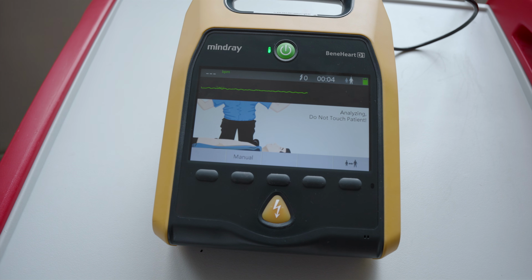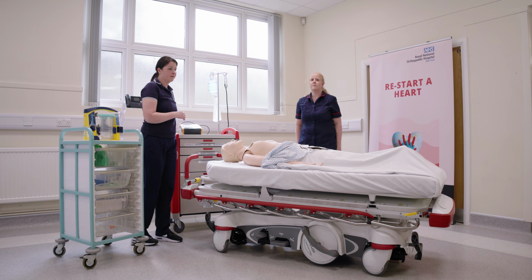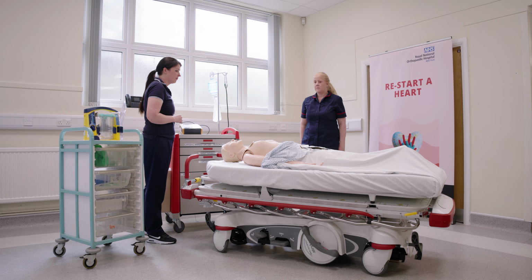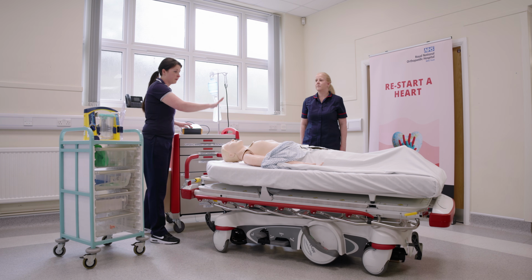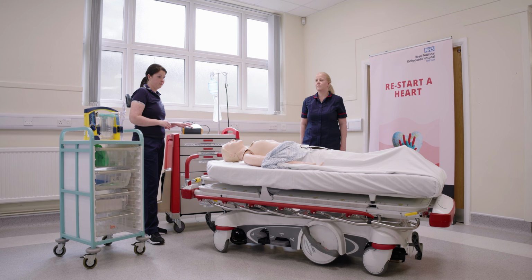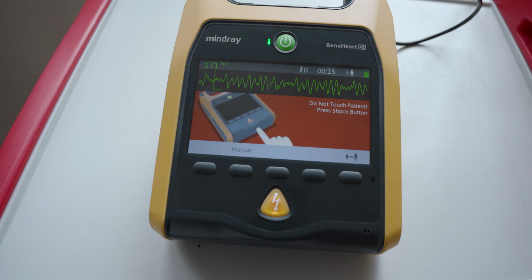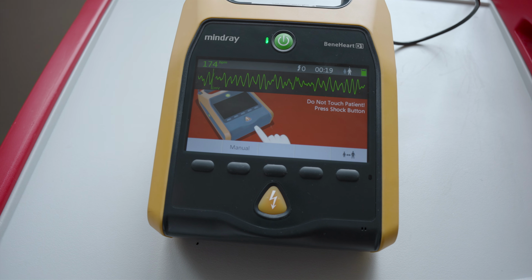Analysing now. Do not touch the patient. Stop CPR when the machine tells you to. If you are operating the defib, check the environment for anyone touching the bed, and all oxygen must be at least 1 metre away from the bed space. If it is telling you to shock the patient, locate the shock button and only press the button when looking at the bed space and the area is clear.